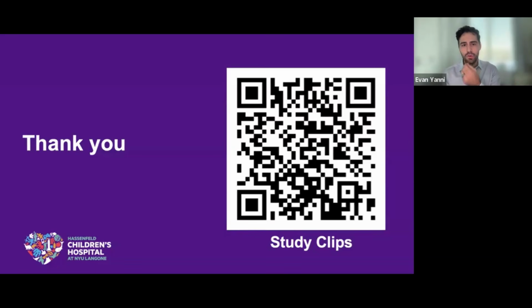And I will use the point of care ultrasound to demonstrate to maybe a family member that there really is no movement going on. If there is slight movement, I won't use it in my decision making at all, is how I've used it in my children. I don't know if E has a different opinion.